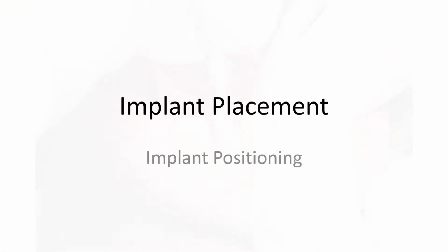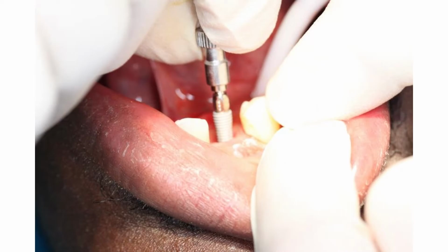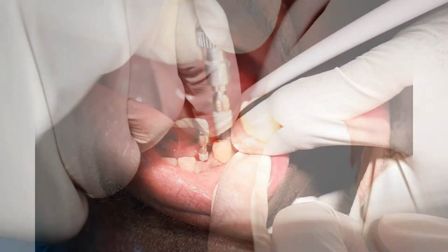Now the implant positioning itself, you take the implant from the box and you start to place it. Now I suggest, although you can do this by driven and powered on a handpiece, I think when you're first starting doing implantology, that's quite dangerous because you lose all tactile sense and feedback, and it's very easy to actually miss the access hole and then the whole thing is ruined. So it's much better, and it doesn't actually add anything to the process whatsoever.